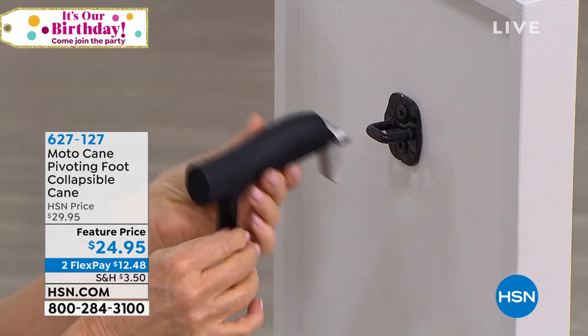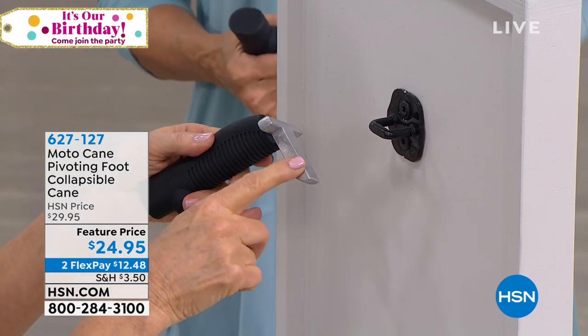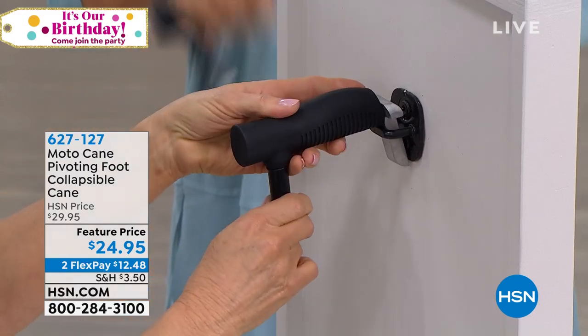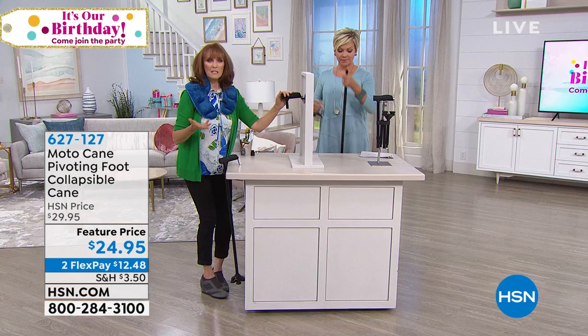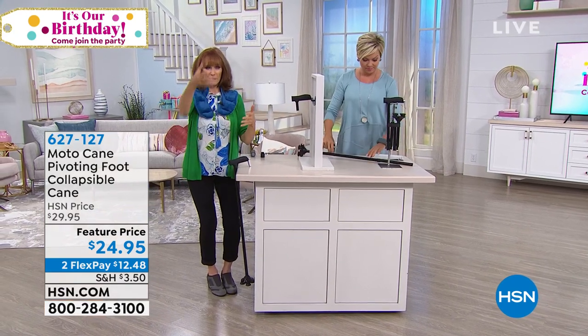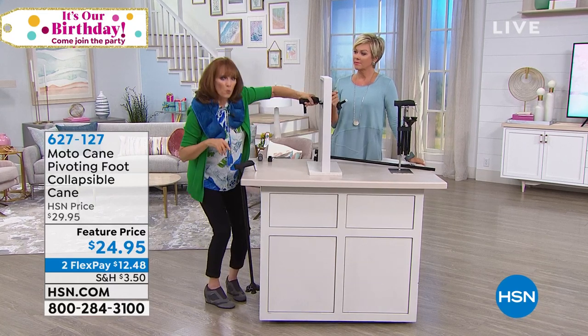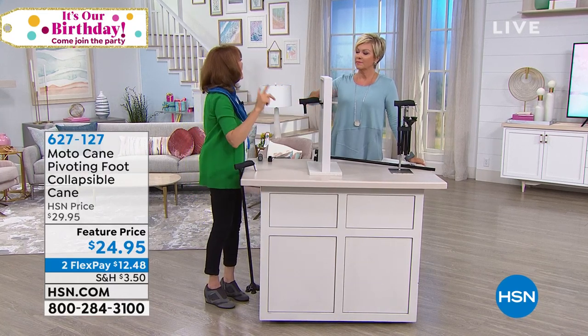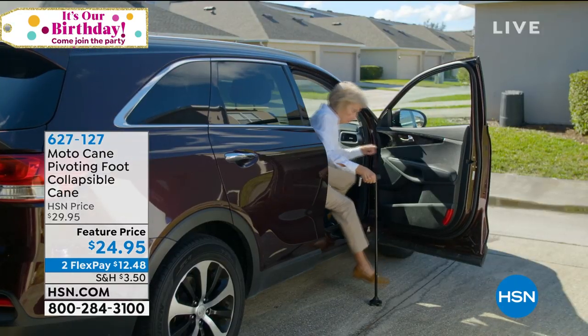When it's off of your cane, this is called the beak, and it's a magnesium alloy. It goes into your striker plate. Now you're sitting in the seat of your car, you turn yourself — instead of asking someone to help lift you out, you have the car assist. You can put your weight on here and push yourself out of the car without help.